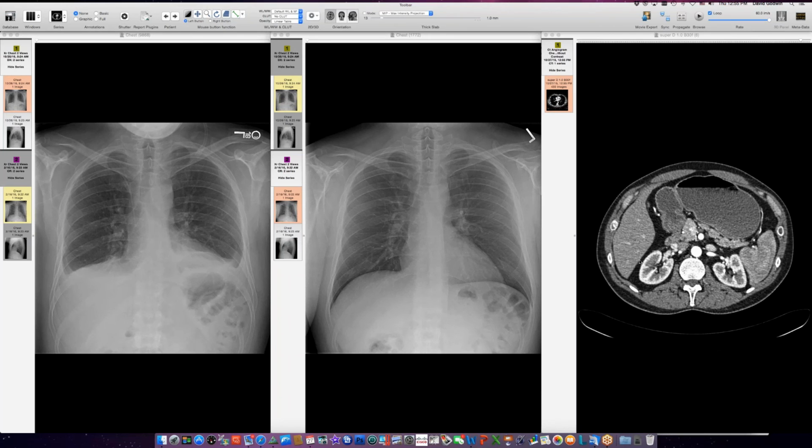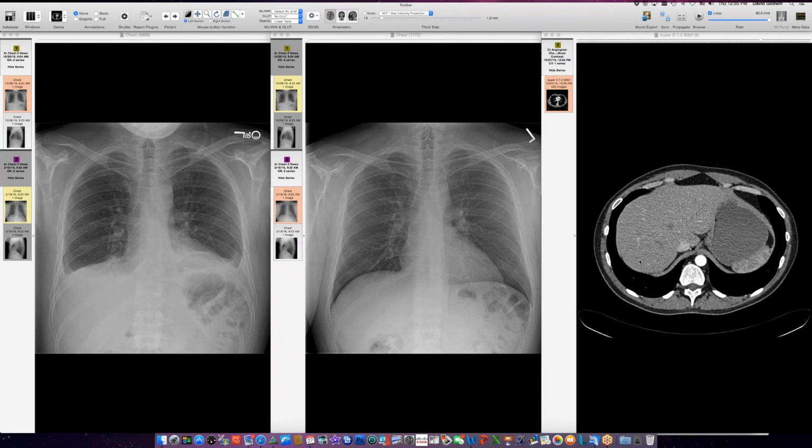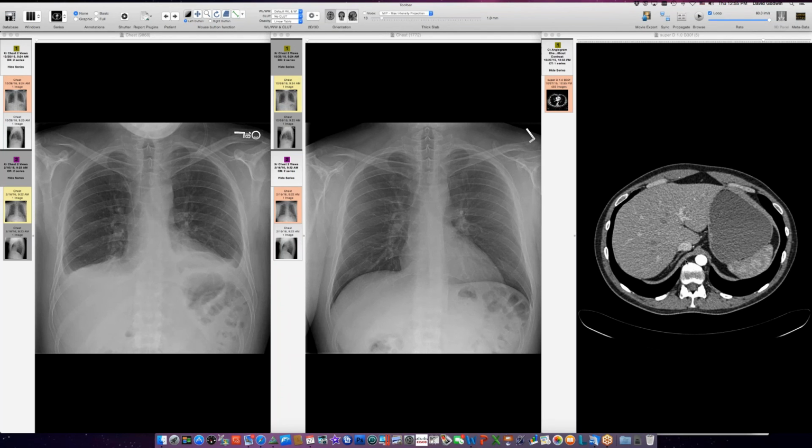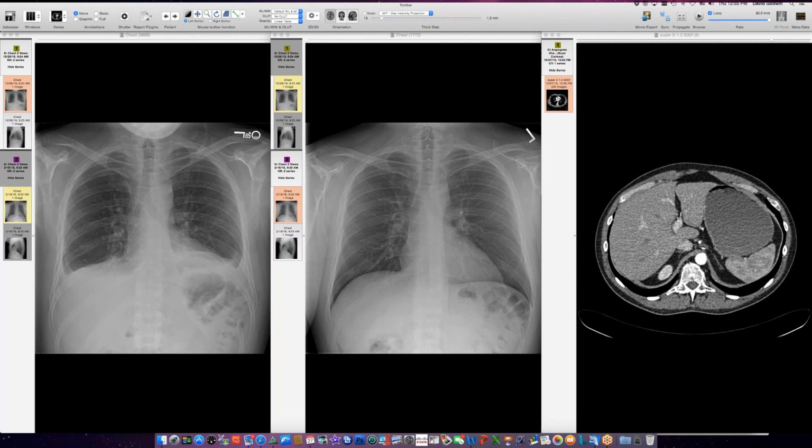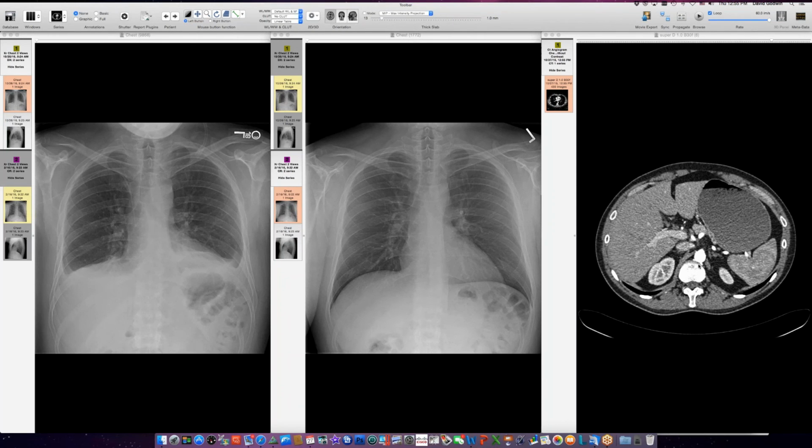And this is a CT scan to show what his diaphragm muscle looks like. It's nice and thick. It's actually a little bit thicker than normal, so he's got good-sized, robust-looking crus here. His CT measurements of his crus are unchanged from exams in 2015 and 2013, so he does not have crus atrophy, but it looks as if he's got a respiratory diaphragm problem here, despite having normal crus thickness.